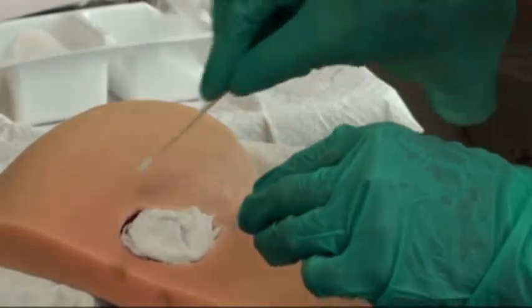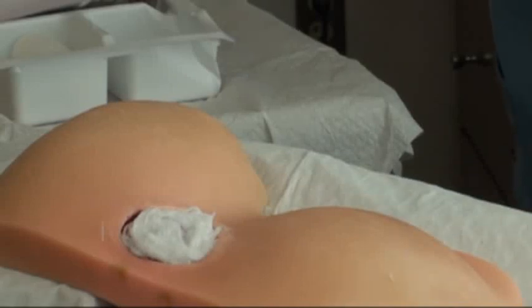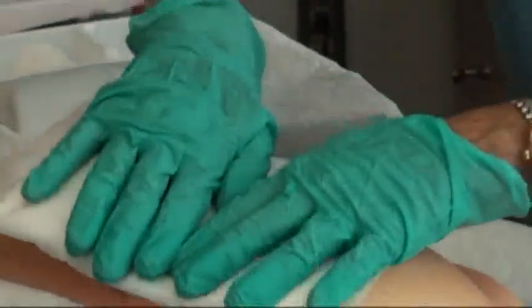The peri-wound does not have any of that on the outside. I want to take this and clean from the top down — toss and go back and clean again. All I'm doing is drying that to keep it dry. Now I'll take these two 4x4s and lay them over it, then take my ABD pad. Now we don't have to be sterile here because the outer dressing is not sterile.